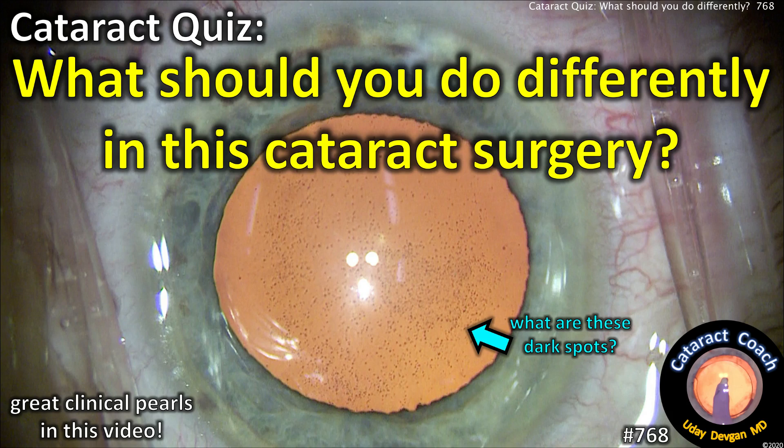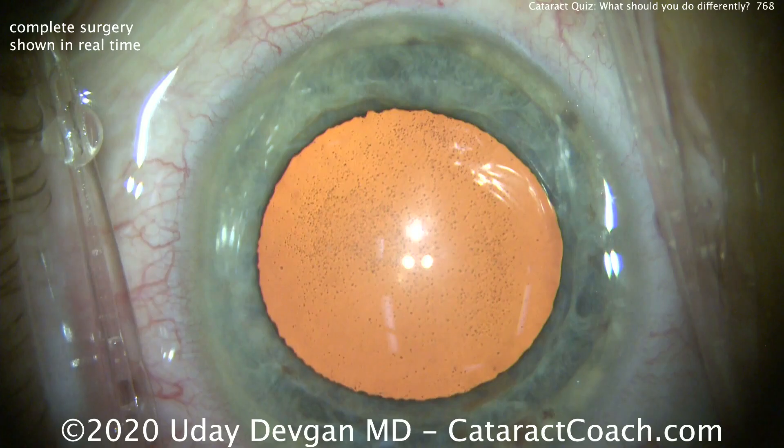CataractCoach.com. We've got a cataract quiz. What should you do differently in this cataract surgery, and what are those dark spots?